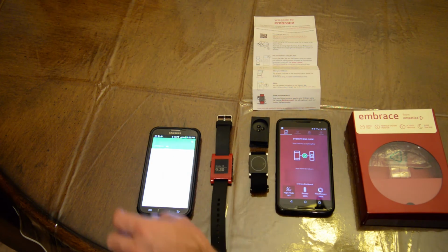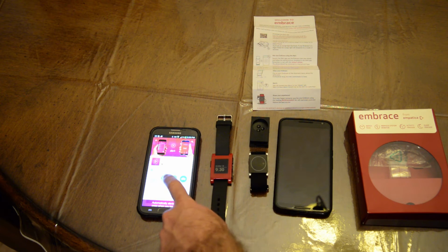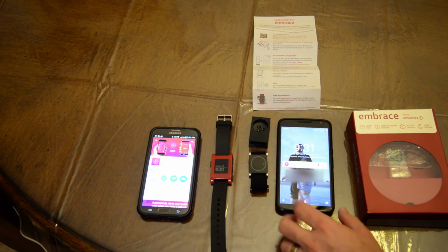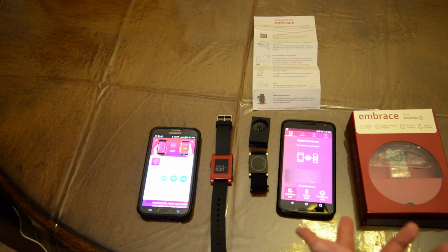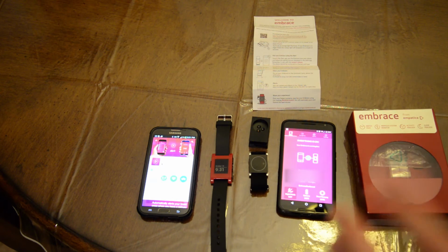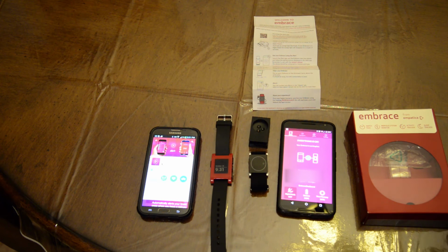As you see here, I'm going to open the Embrace app, and it says right there that it's not compatible with this version. So I'm assuming that it only works with Lollipop or above. So your Nexus 6 that we have will definitely be compatible. Other devices, such as Apple's, I'm pretty sure will be compatible. Just be aware that the old phones that you have won't work for this Embrace watch. That might be a big hassle to you if you have that issue.